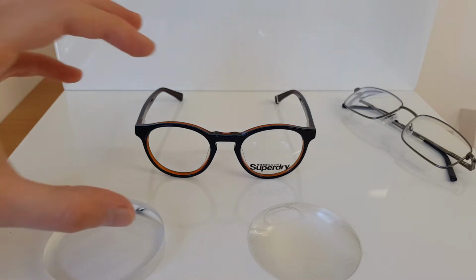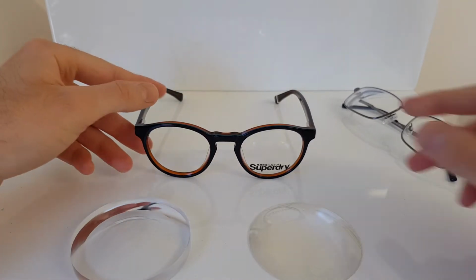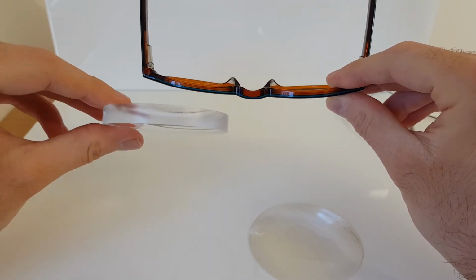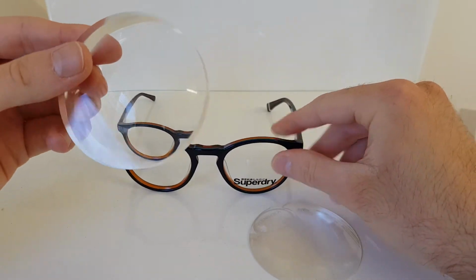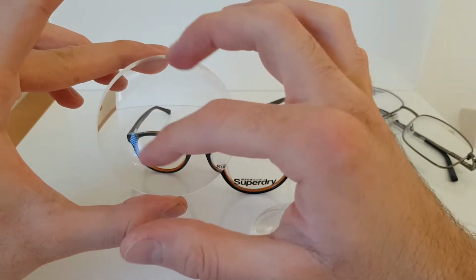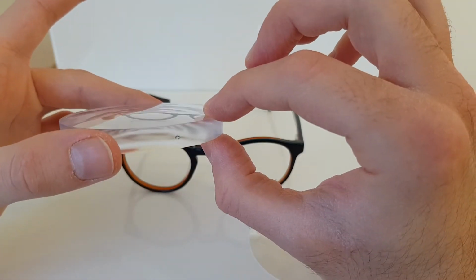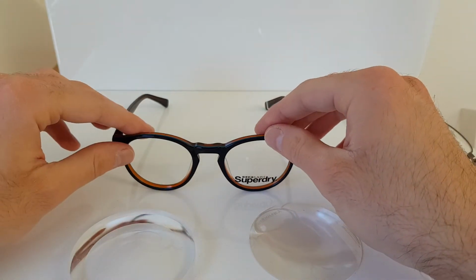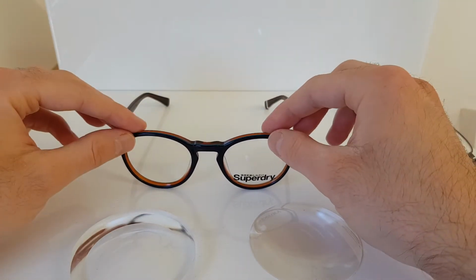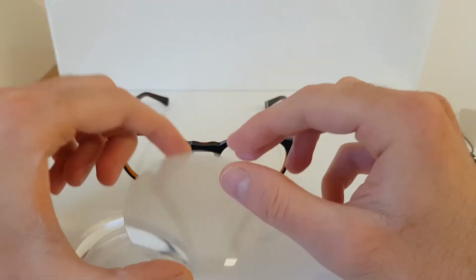So when we make the frame smaller, obviously there's going to be less lens in here. And when there's less lens in there, it's going to reduce the thickness. So with like a minus prescription, for example, because the lenses get thicker as we go out to the edge, if we're using a smaller diameter lens, we're going to be actually having less thickness on the edge. So if you had this frame in two sizes, a smaller frame would be lighter and a bigger frame would be heavier, purely because we're going to be getting rid of a lot of the excess lens.